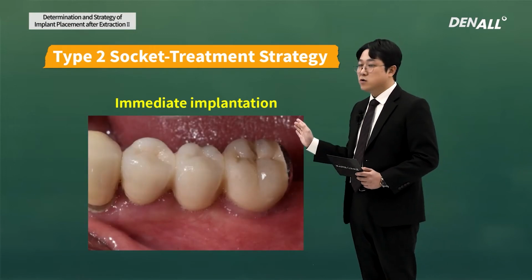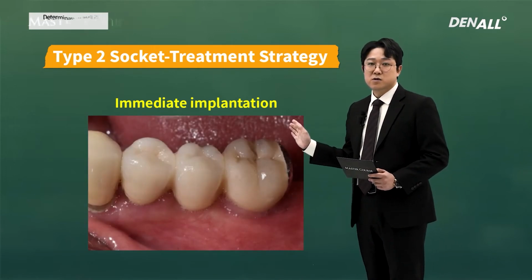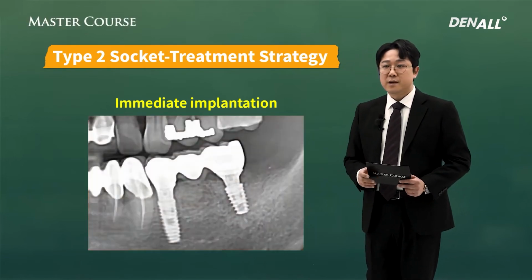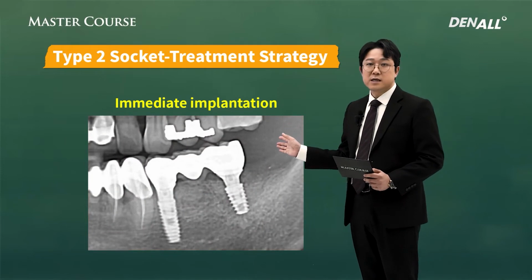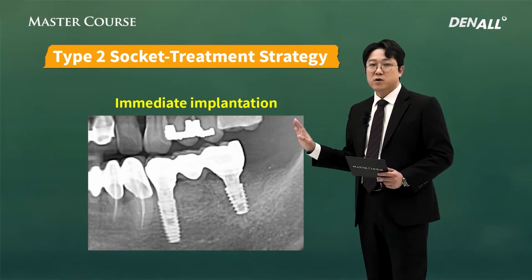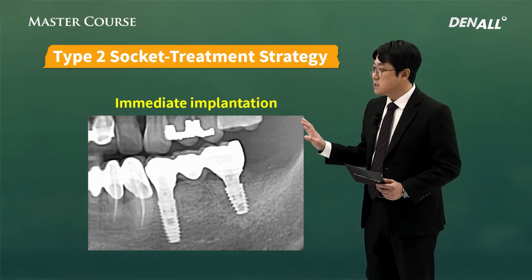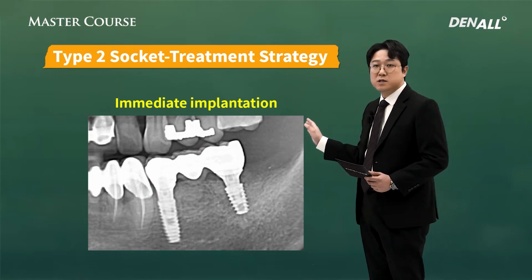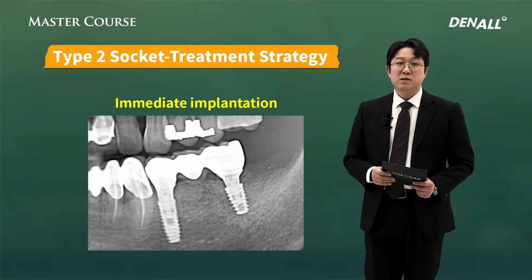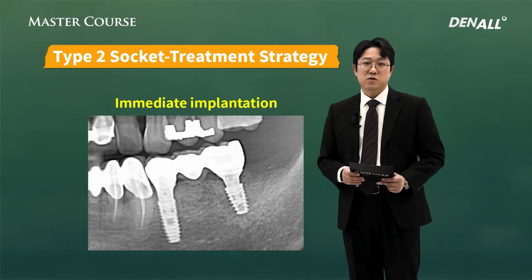After implant placement, 4 months later, the treatment was complete. This is the patient visit after treatment completion. In number 34, there is not a lot of buccal bone loss in the X-ray image, but in the distal bone loss in number 36, you can see that bone is growing in.